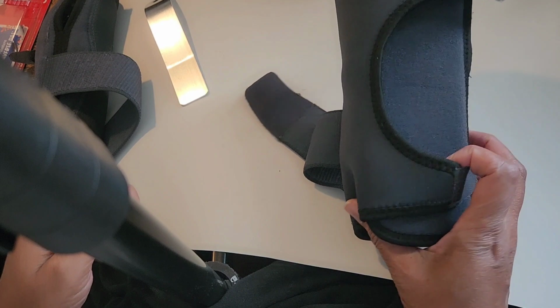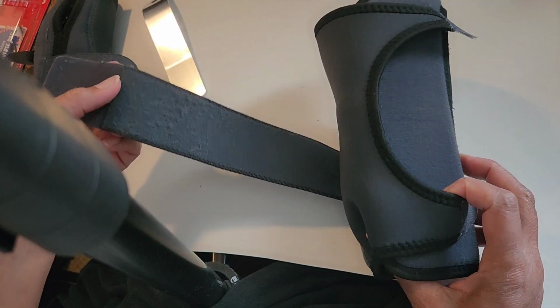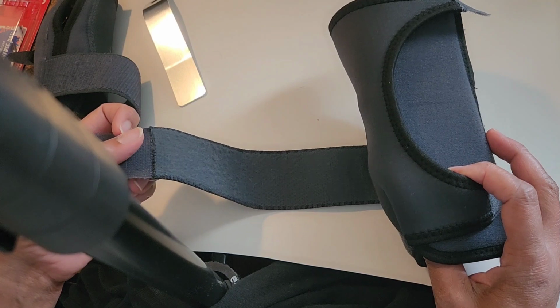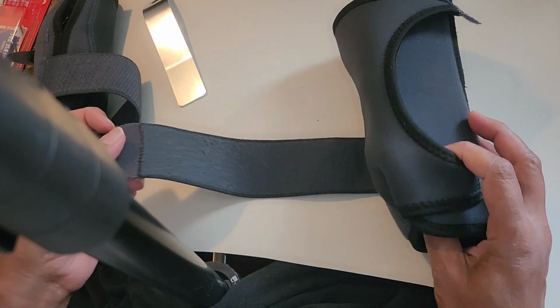I just want to show you my wrist brace that I use. My doctor said that I'm showing symptoms of carpal tunnel. I have the numbness and the tingling in my hands. So he recommended that I get a brace to wear.